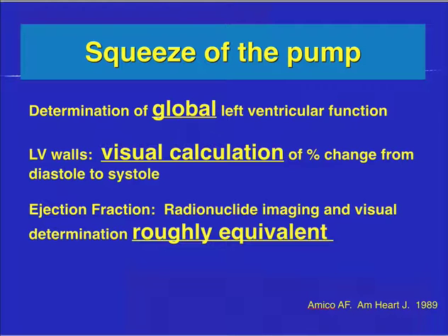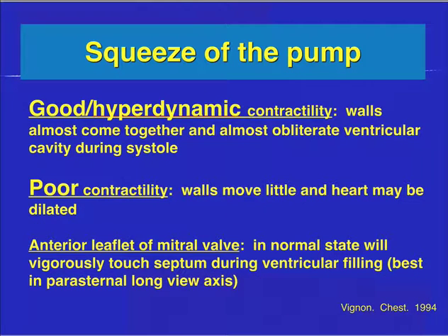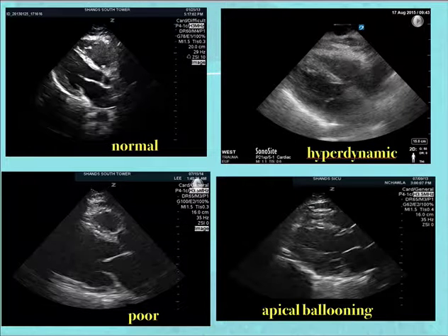This actually makes your assessment easier. With good and hyperdynamic contractility, the walls come almost all the way together and nearly obliterate the ventricular cavity during systole. With poor contractility, the walls move little and the heart may be dilated. The anterior leaflet of the mitral valve in the parasternal long view can also be assessed — in a normal state, it should be touching the septum during ventricular filling.